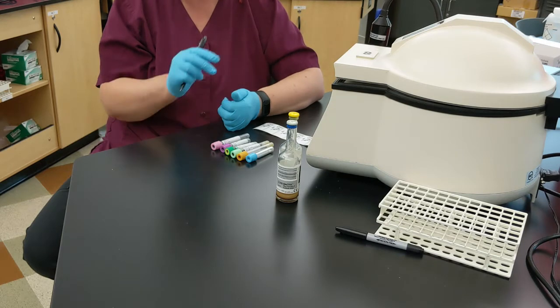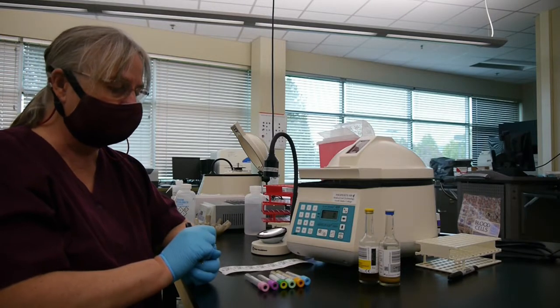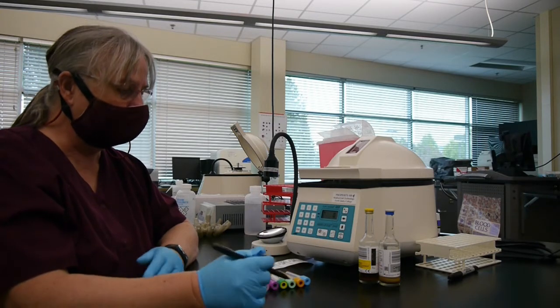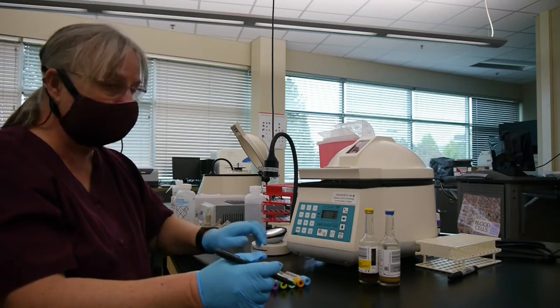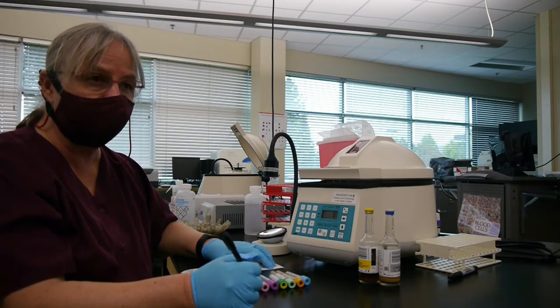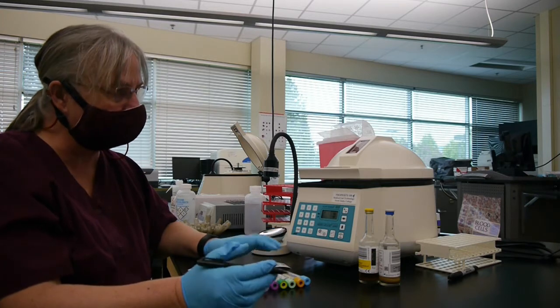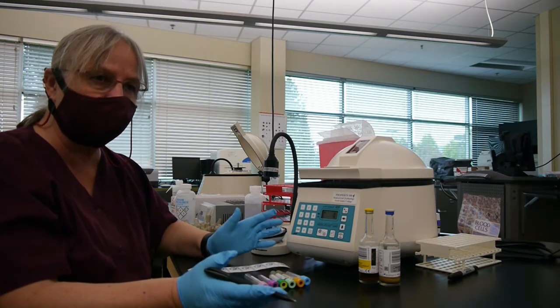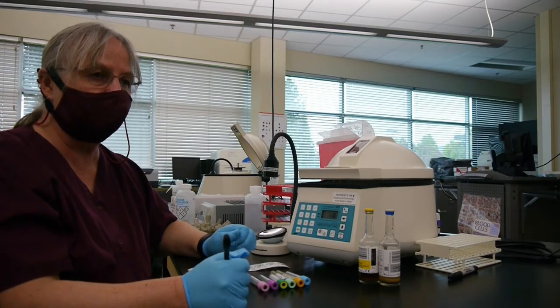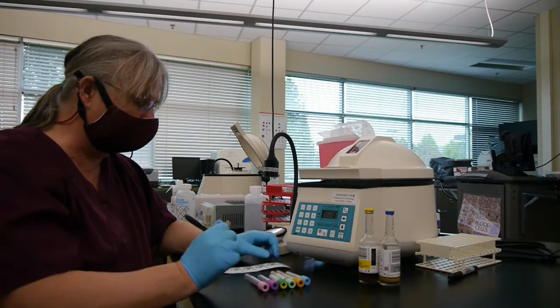You may have your patient holding the gauze while you start labeling your tube. Labeling the tube is so important. You want to put the date, time, and your initials so you're taking responsibility for the identification of the patient, and you can be referred back. Sometimes stuff might look funny to us regarding lab results, and it's always nice to be able to go back and double-check any pre-analytical issues with the person that was actually there — and in that case, that would have been you.